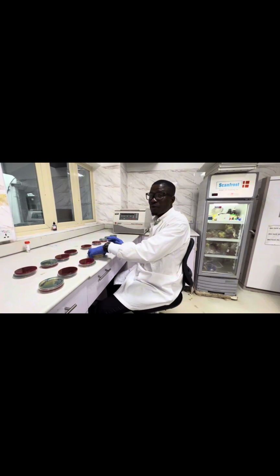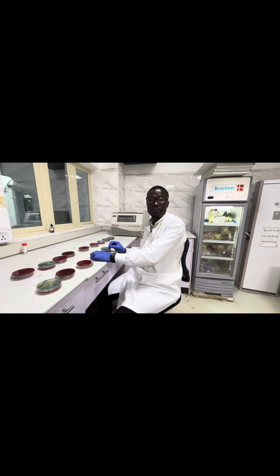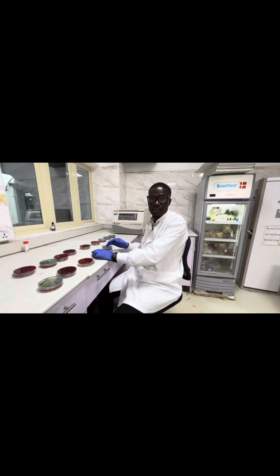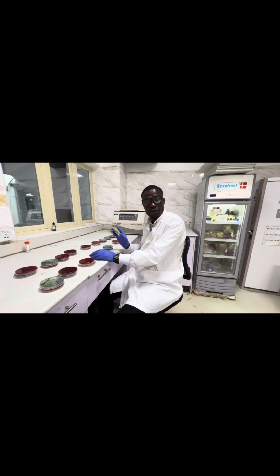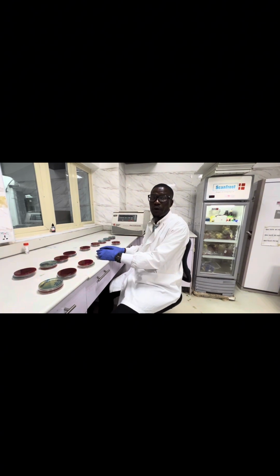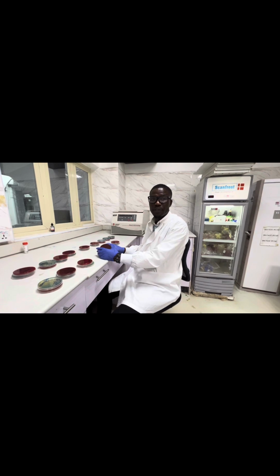On colonial morphology, we are going to look at the size and the color. You are also going to look at whether it is elevated or flat. On the CLED, you are going to check if it is a lactose fermenter or non-lactose fermenter. You are also going to look at the moisture of the organism, then the shape, which is very important.